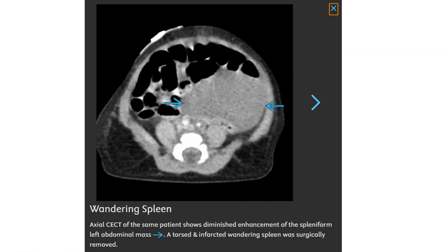This is the contrast-enhanced CT of the same patient, showing absent enhancement of the splenic-form left abdominal mass. The torsion and infarcted wandering spleen was surgically removed.